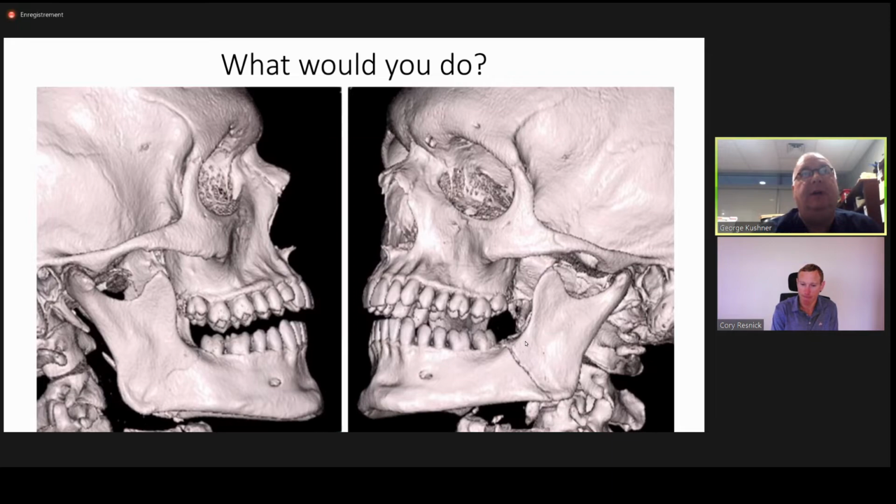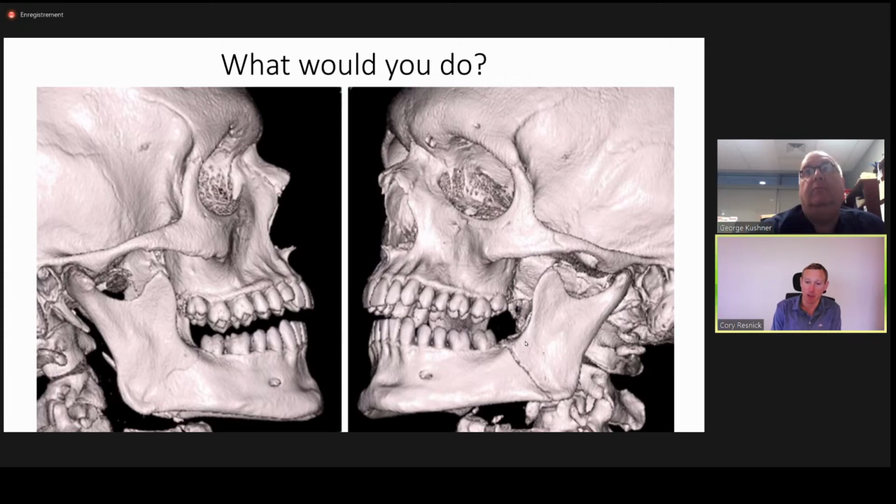Yeah, really good question. Very nuanced answer, I think, depending on the patient scenario and their premorbid situation. Things like, are they currently wearing dentures prior to their fracture, in which case you may choose to use their existing dentures as Gunning splints, as opposed to creating their own Gunning splints, for example.